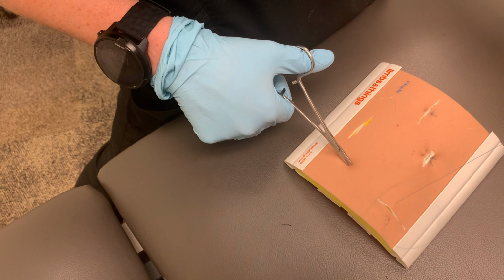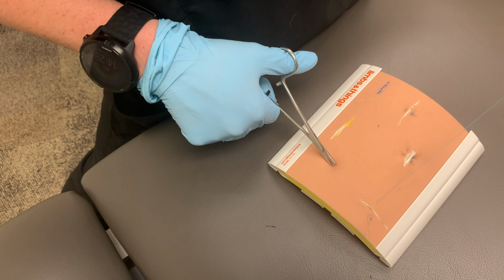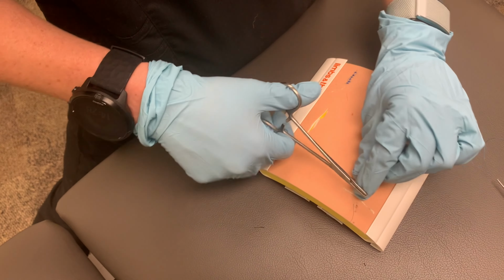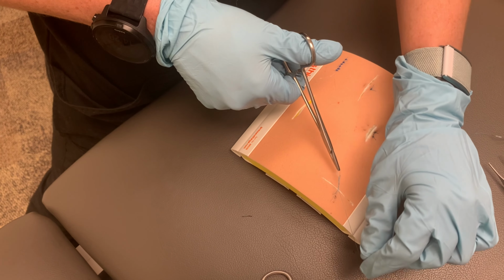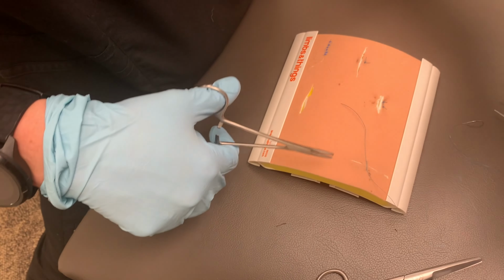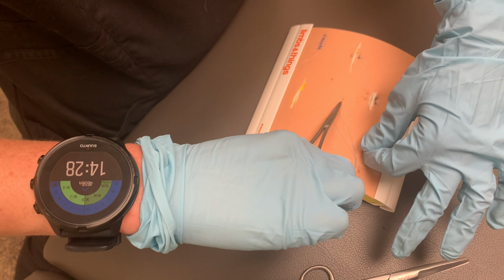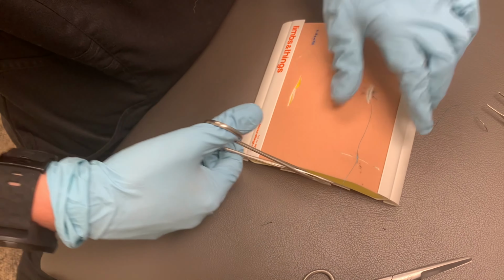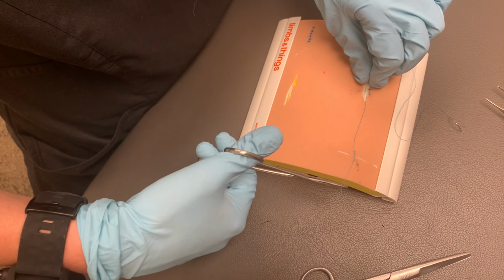She'll pull that suture all the way through, leaving a slight tail at the end, and then she's going to throw her first knot by wrapping the needle driver twice and grabbing the tail to pull through that wrap. She's going to now throw her second knot by doing a single wrap of the needle driver and pulling the tail through from the opposite direction. She'll alternate direction with each knot, and because this is a 3-0 suture, she will do a total of 3 knots.